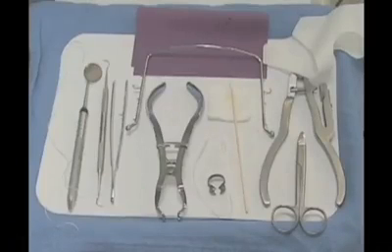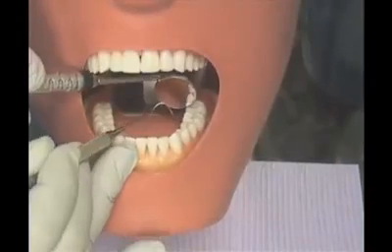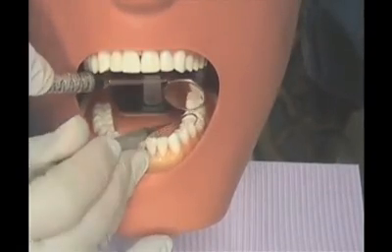Preparing, Placing, and Removing the Dental Dam. Review your tray setup making sure you have the equipment and supplies required. Use the mouth mirror and the explorer to examine the site where the dam is to be placed. It should be free of plaque and debris.